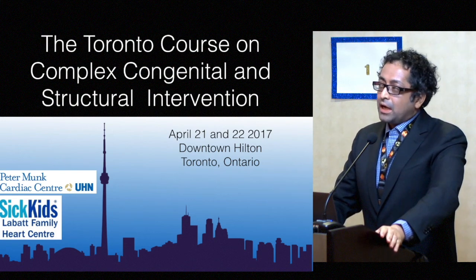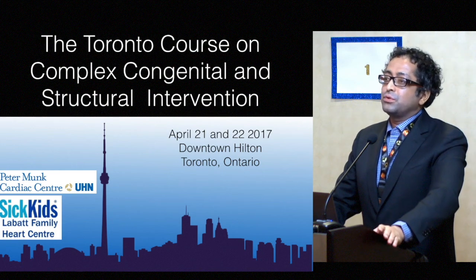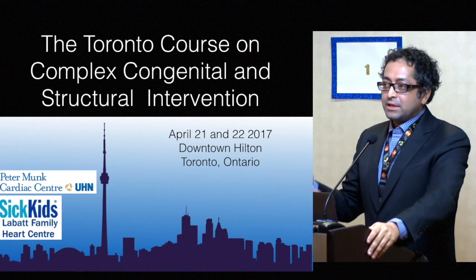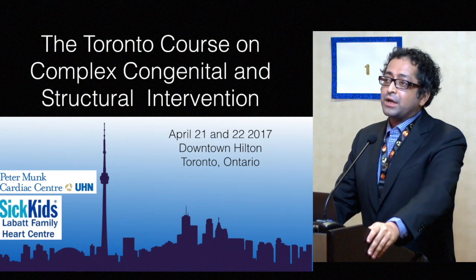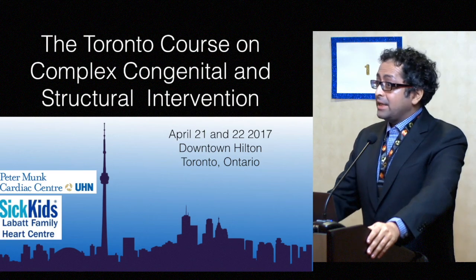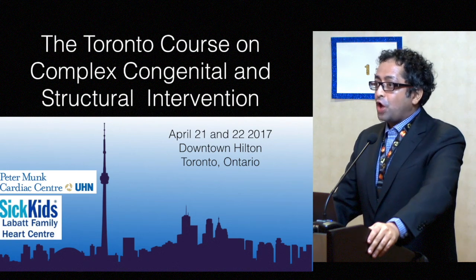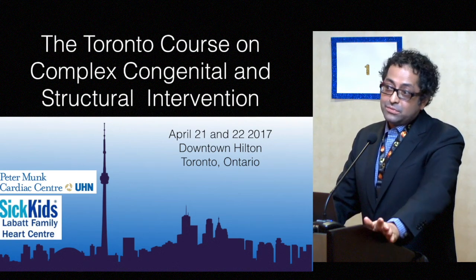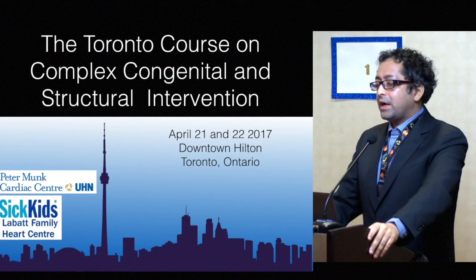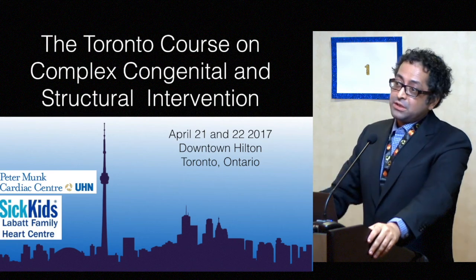And I do think it has a lot to do with who did a lot of transapicals and who feels comfortable from the surgical standpoint. Our surgeons feel very, very comfortable with the transapical procedure. Again, you're right, it is more morbidity. The procedures with transseptal are a lot longer, no question, with the Edwards valve. We have not done them with the Melody valve. I've seen publications. You've done them?